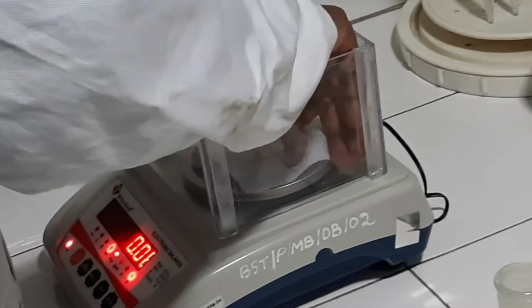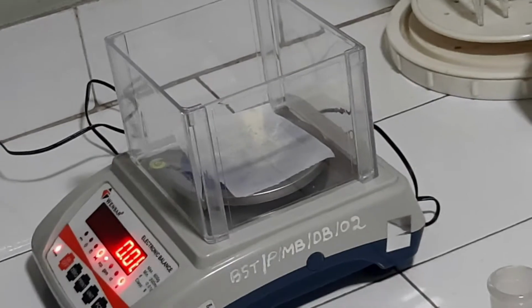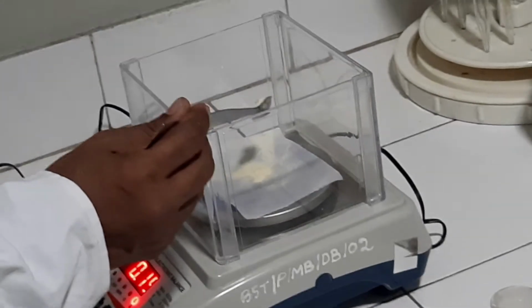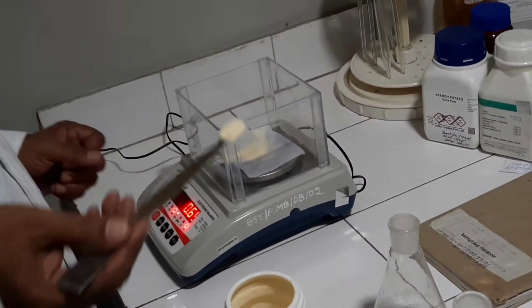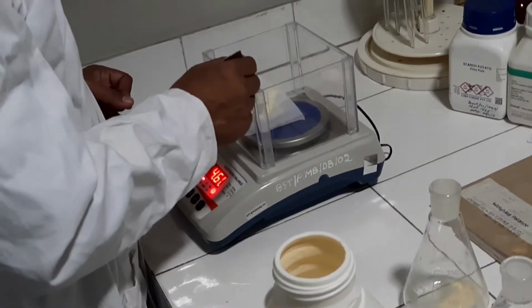Now I am going to weigh again. You will have to handle it carefully and very fast because beef extract is very hygroscopic, almost like sodium hydroxide. You have studied this in analysis class. There is something in excess, so we will take it out.